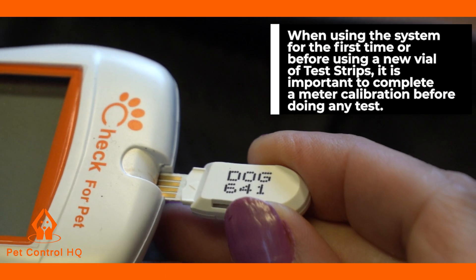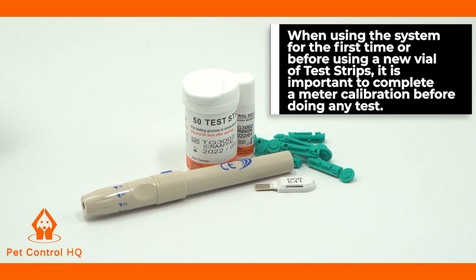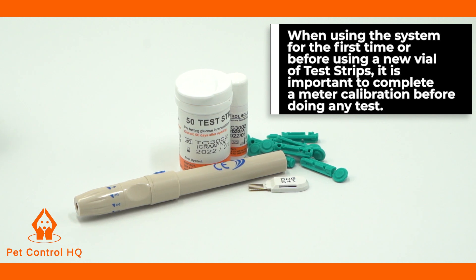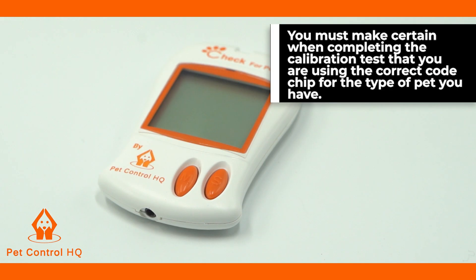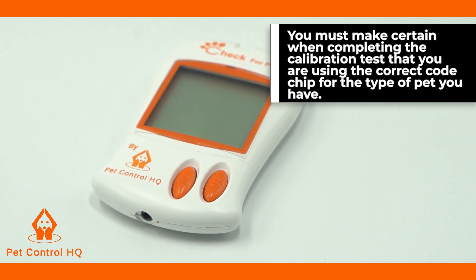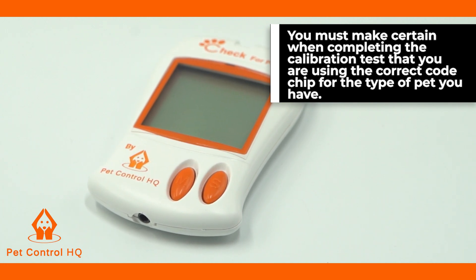When using the system for the first time or before using a new vial of test strips, it is important to complete a meter calibration before doing any test. You must make certain when completing the calibration test that you are using the correct code chip for the type of pet you have.